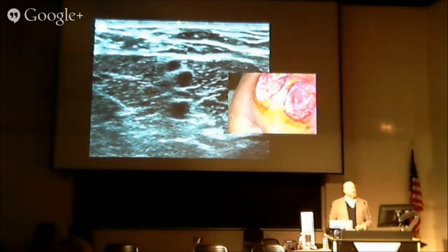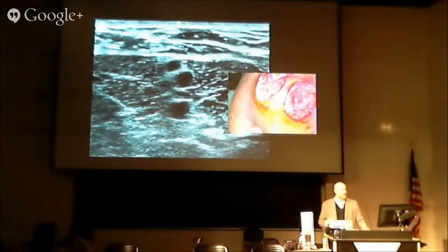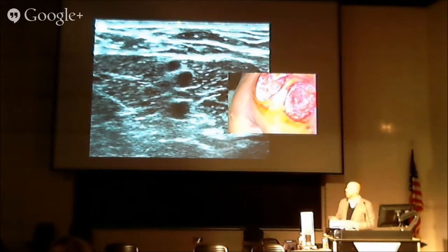And the problem is, when you're getting shot at, and you sedate a 280-pound man, and they start walking the mortars in, guess who's got to drag this bad hind end away? Me. And I'm already wearing all my gear. I don't want to drag this bad hind end. I've got my own fat hind end. I need to get out of the area. So what we would do is we take ultrasound, and we do an interscalene nerve block. And this guy would have absolutely no pain, and we could completely evaluate this one.